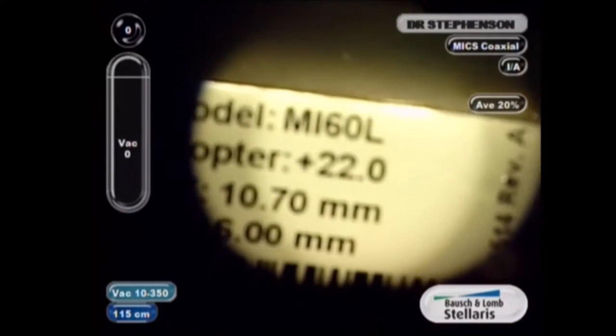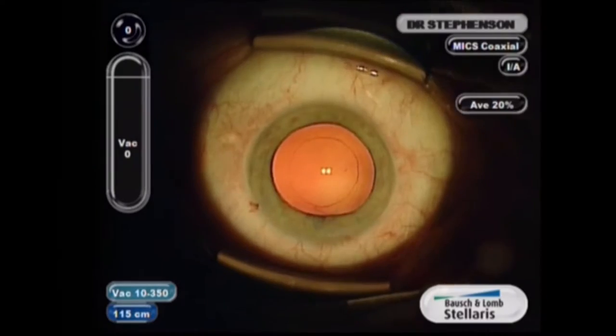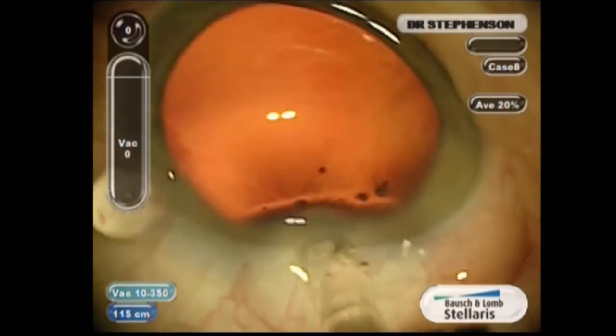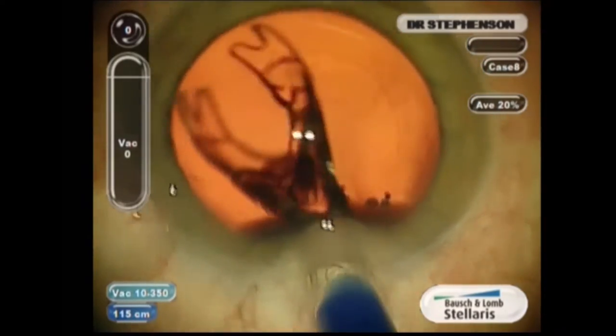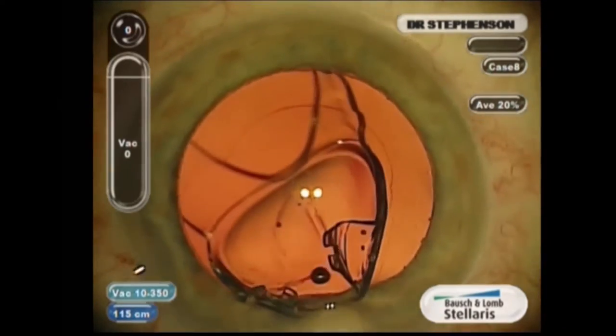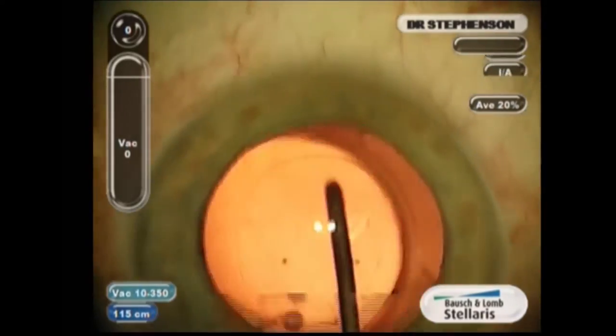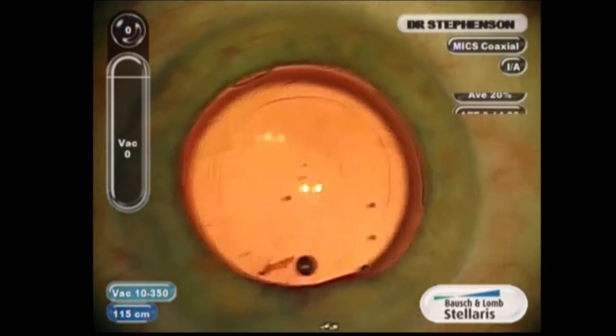I'm just showing you here. And I do this on all cases when I video them, just so I know what was in the eye if I forgot. So what I do — this is a different injector. You push down and the lens easily opens. And then I take a second instrument and place it in the bag. I'm going to pause the video here because I'm going to tell you a couple of things.